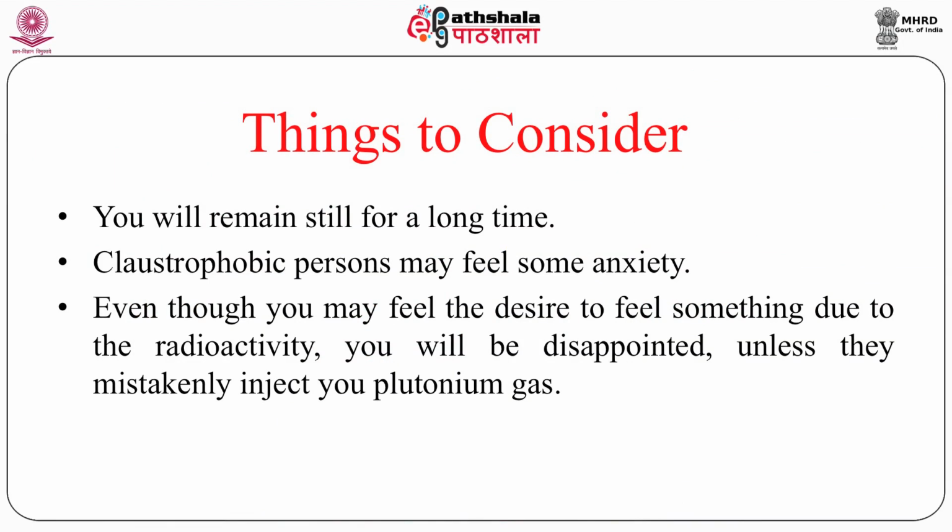Now, what are the things to be considered? You will remain still for a long time. Definitely you have to wait for 45 minutes before the scan is carried out. A claustrophobic person may feel some anxiety because you have to be in the PET scan for a long time, for 25 or 30 minutes, and you have to be placed there. They may feel some kind of discomfort.